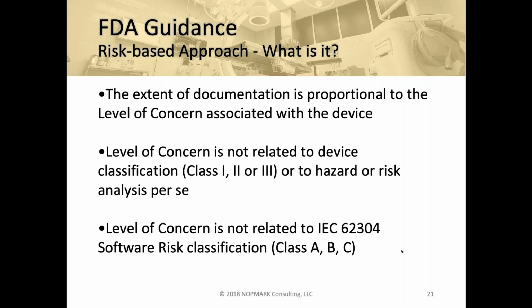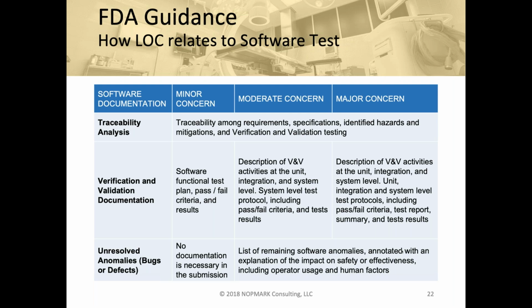All of these classes really are risk-based, from the lowest level, something that can cause no injury, to the highest level, something that can cause serious injury or death. So while all of these classifications are different, they are risk-focused, driven by that safety impact, that risk impact, and how much you do frequently gets to the software testing level.